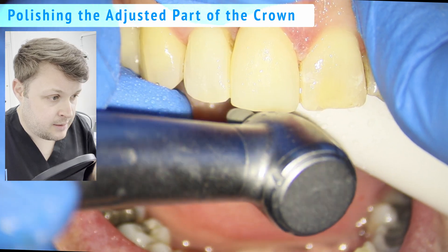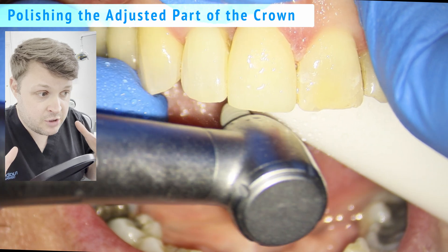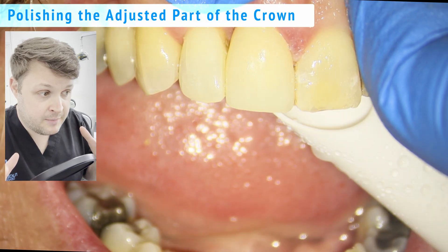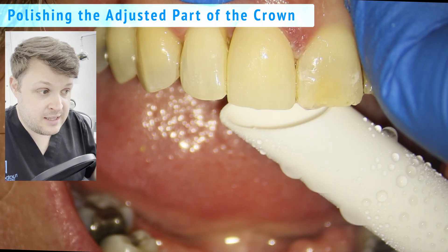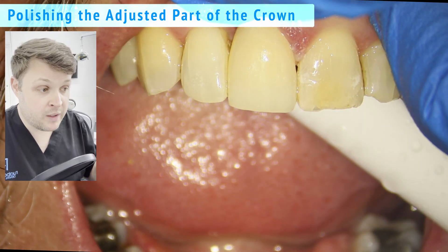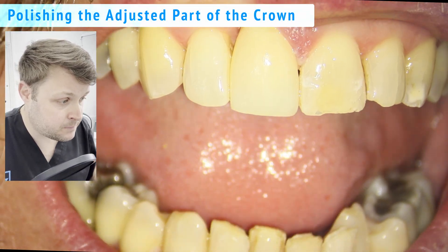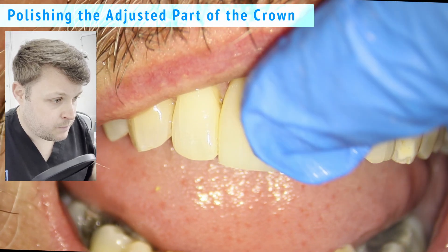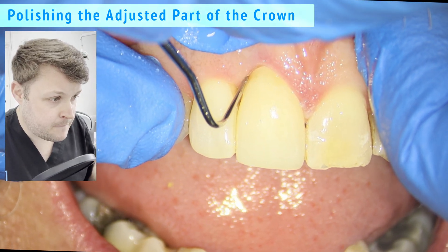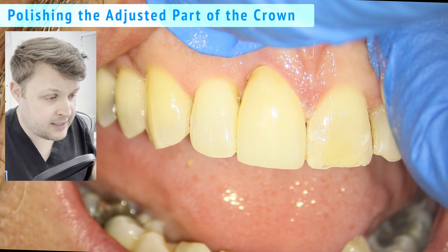Don't forget: when you use a diamond drill on a zirconia crown or anything di-silicate, it will need to be polished afterwards, otherwise it will excessively wear its opposing counterpart. And here I'm just removing the last little bit of excess cement.